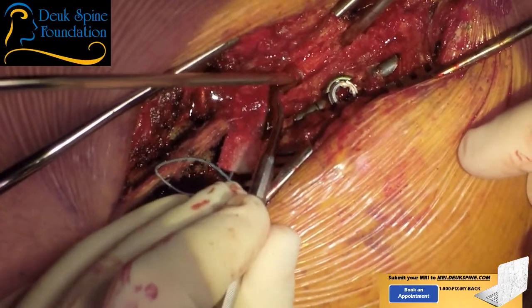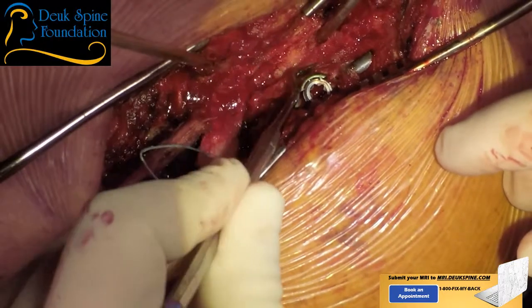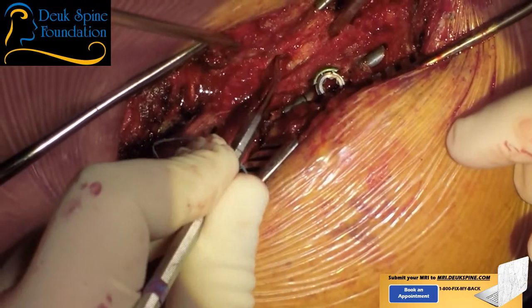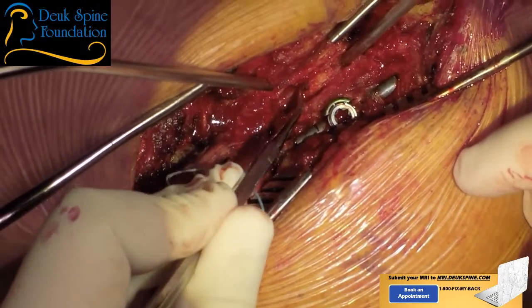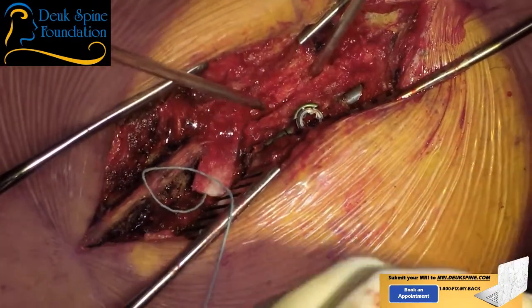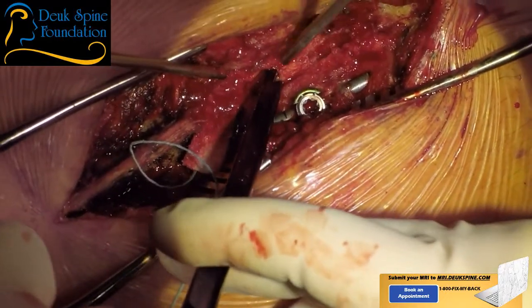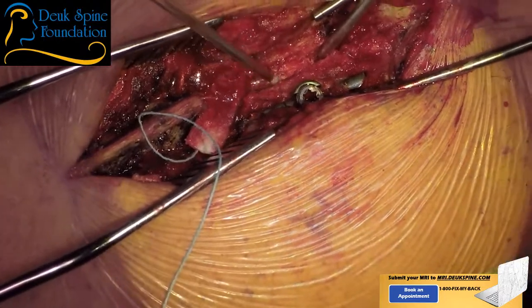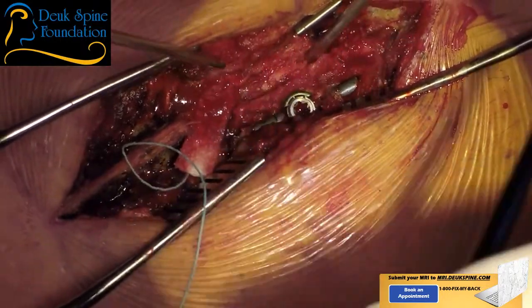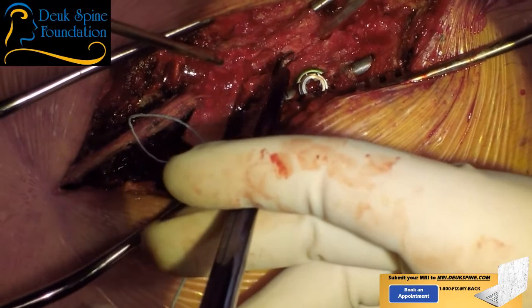Suck here. I need to see. Damn, look at that. Oh, yeah, finally. Not yet. Sweet Jesus. That is ugly. All right, Kerrison. Yeah. More volume. Okay. A little bit. Look at that thick ligament. That was crushing the spinal cord. It's not normal. It's hypertrophied. And now we're unpinching. This is good.